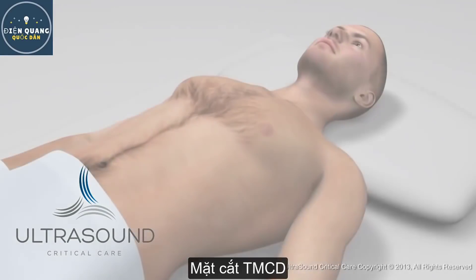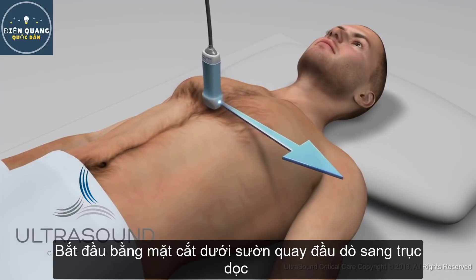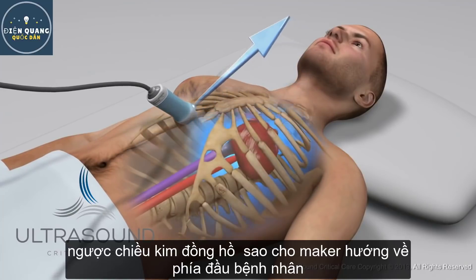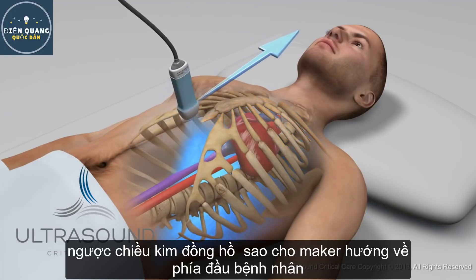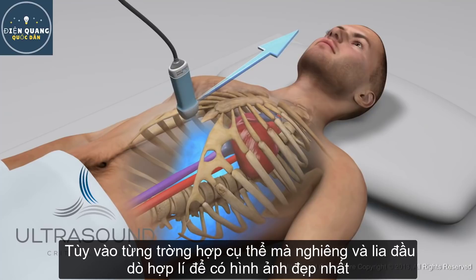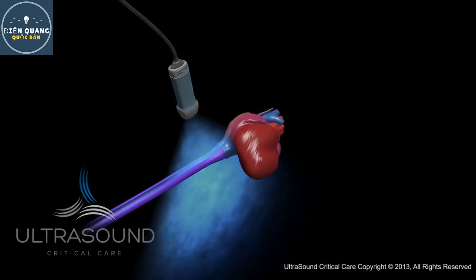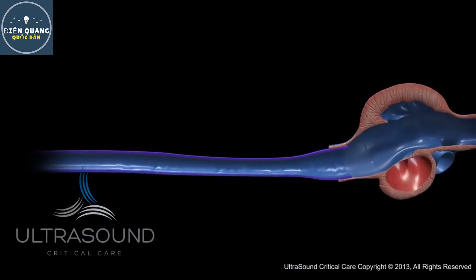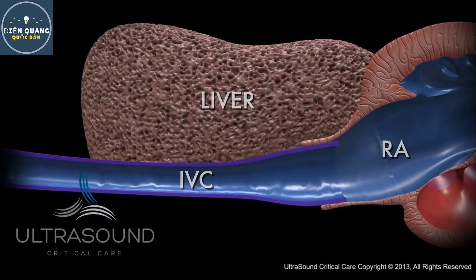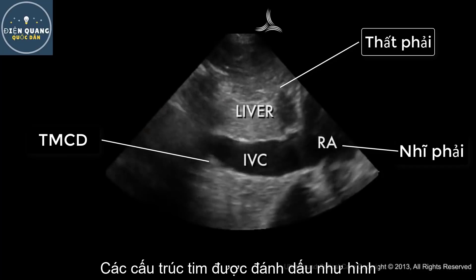The inferior vena cava. To obtain the IVC view, begin with the subcostal view and narrow in on the right atrium. Turn the probe counterclockwise until the dot is facing the patient's head. Slightly tilt the probe to the patient's right to bring the IVC into view. Note the IVC runs through the liver. The structures are labeled.